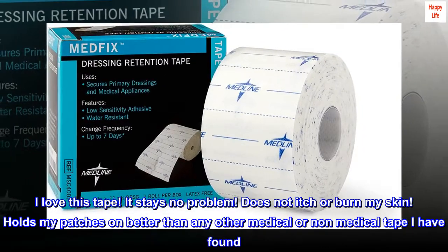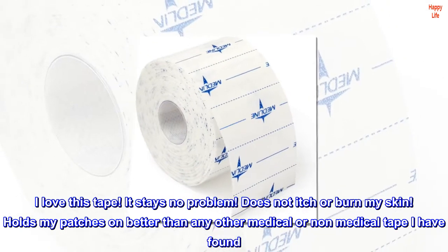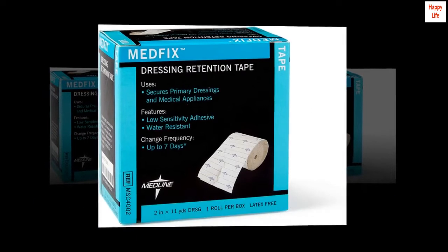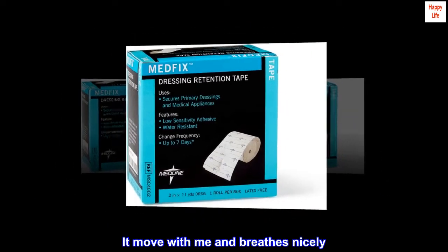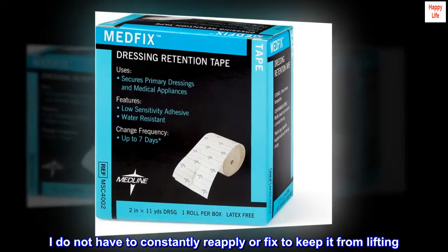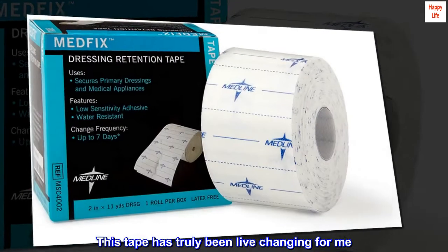I love this tape. It stays no problem. Does not itch or burn my skin. Holds my patches on better than any other medical or non-medical tape I have found. It moves with me and breathes nicely. I do not have to constantly reapply or fix to keep it from lifting. This tape has truly been life-changing for me.